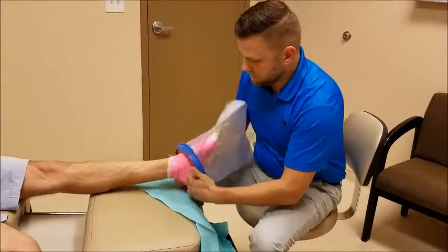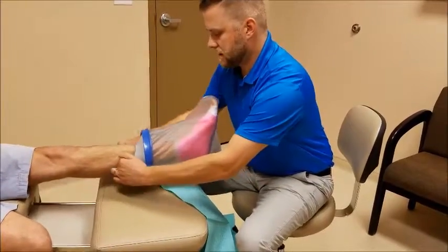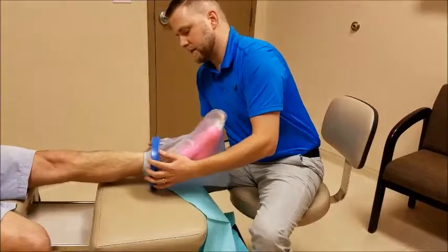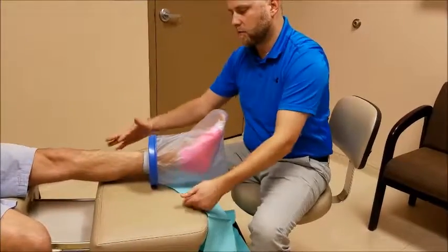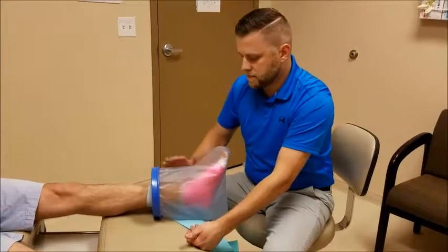When you're doing this to yourself, you can be more cautious — quickly put it on so you don't hurt yourself. Once you get it on the leg, you kind of pull it down slightly. What that does is create a ramp effect, so the water will want to roll down off the actual bag.